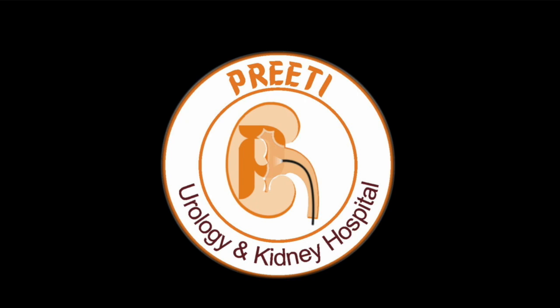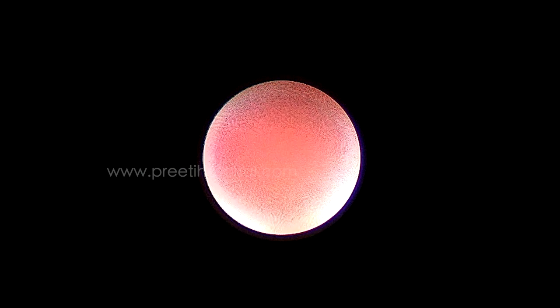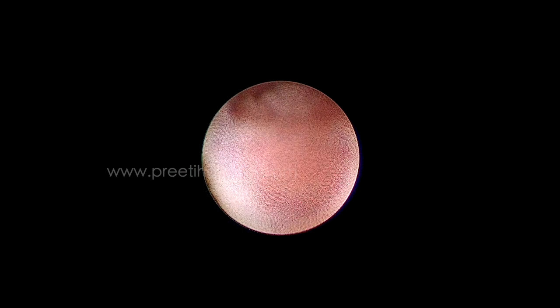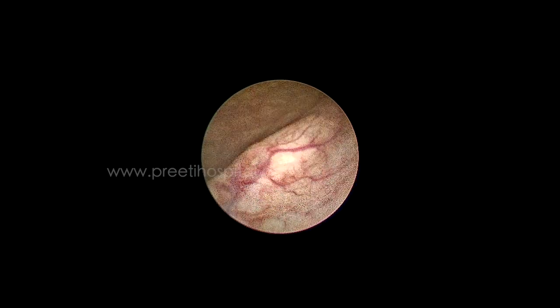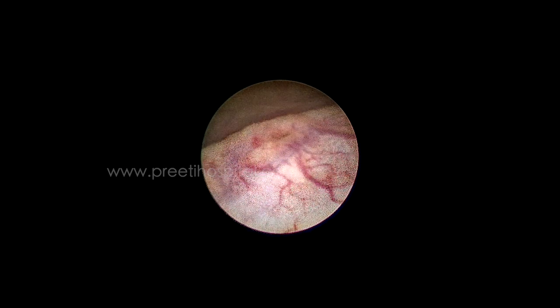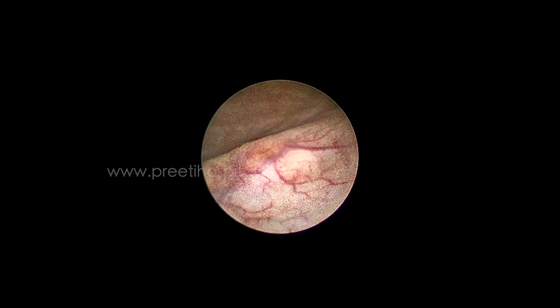I am sharing this unedited video for juniors who attempt ureteroscopy when the ureter is very tight. This is a common scenario, basically for beginners. If you see here, I am entering into the urethra through the 6 by 7.5 ureteroscope which is commonly used. When you first see without passing a guide wire, please do not attempt ureteroscopy in the beginning. Guide wire passage is essential because ureteric orifice entry is important.